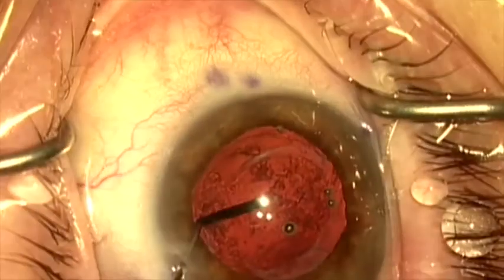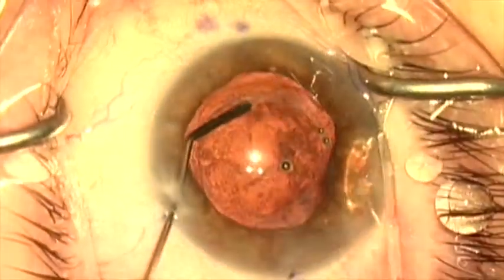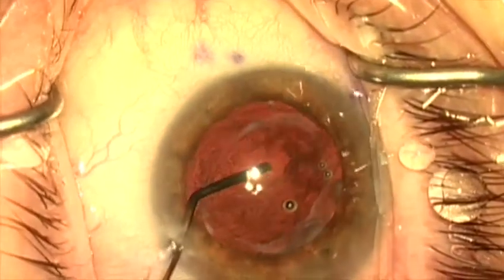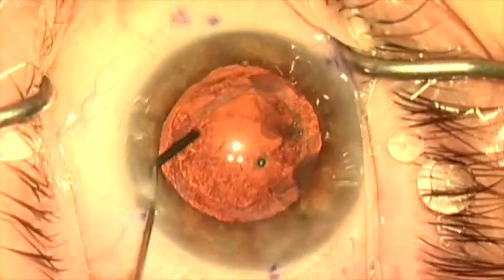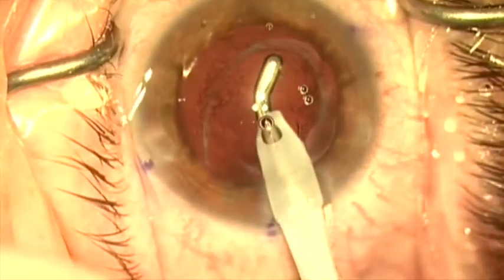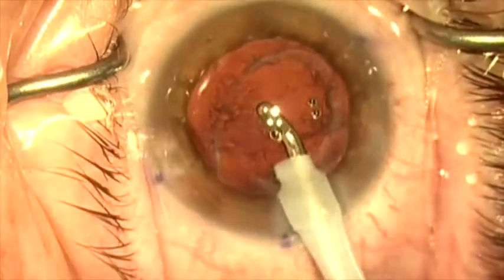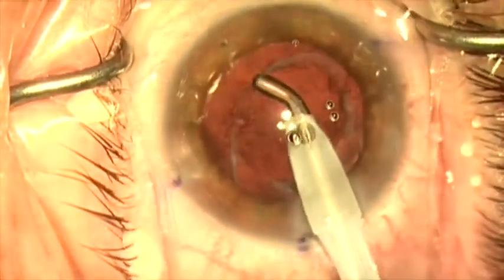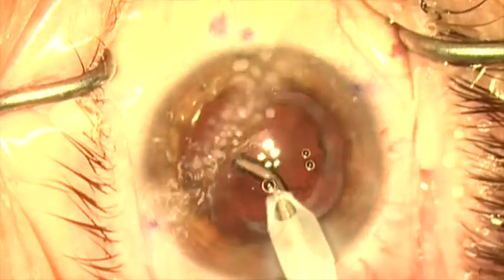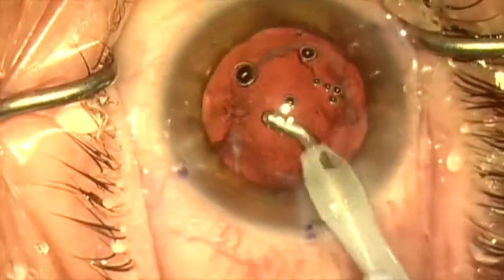Now that the lens is removed, I'm going to irrigate some of this crud off the posterior capsule. Most of what we think is posterior capsule haze is really lens epithelial cells and fibrosis superimposed on the posterior capsule, and this can usually mostly be removed as you see here. I've loosened it up and now I'm vacuuming the fibrosis and lens epithelial cells off the capsule as much as possible to clear it up.